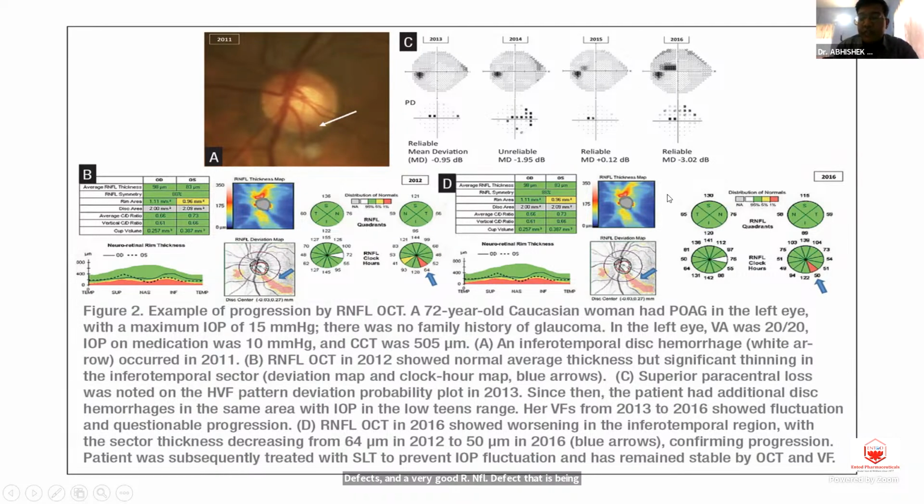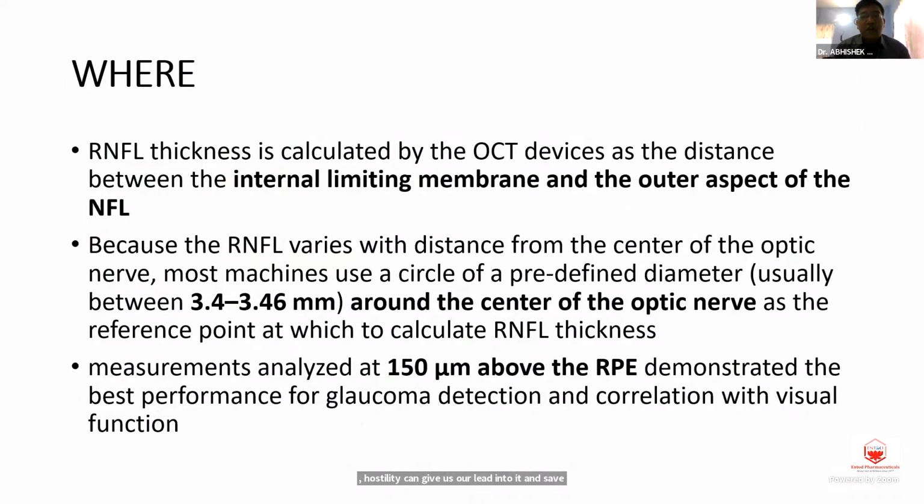So for disease progression, it is visual field analysis that we go by. Obviously, that is where we treat. But yes, OCT can give us a lead into it and save the vision, obviously.